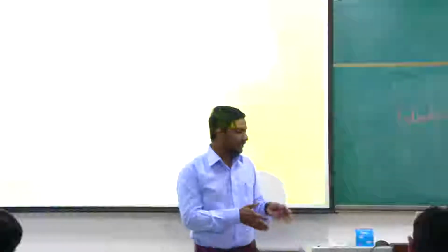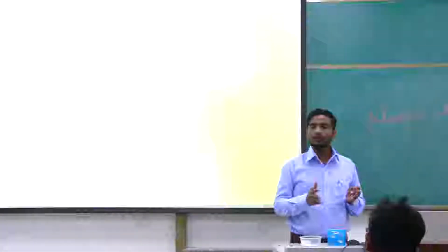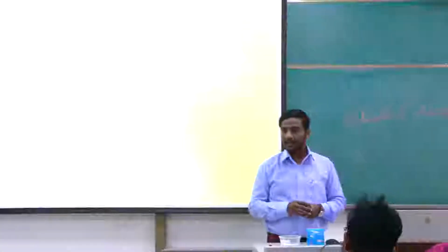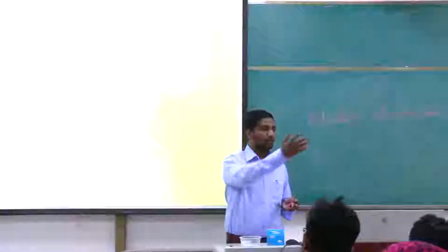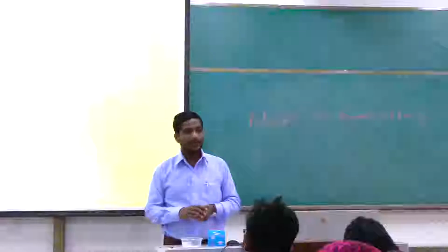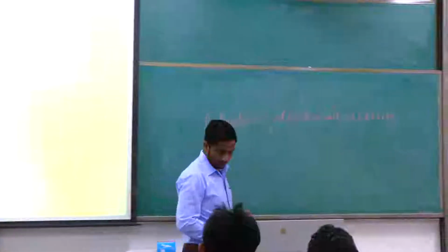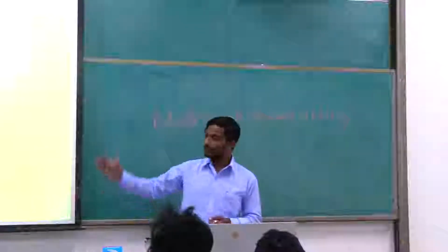So in the very beginning of this class, I want you to understand that ECG can correlate with the mechanical activity, but ECG cannot show us 100% mechanical activity. It is not possible at all. We have got some other methods. We have got echocardiography and other things to see the mechanical activity of the heart.